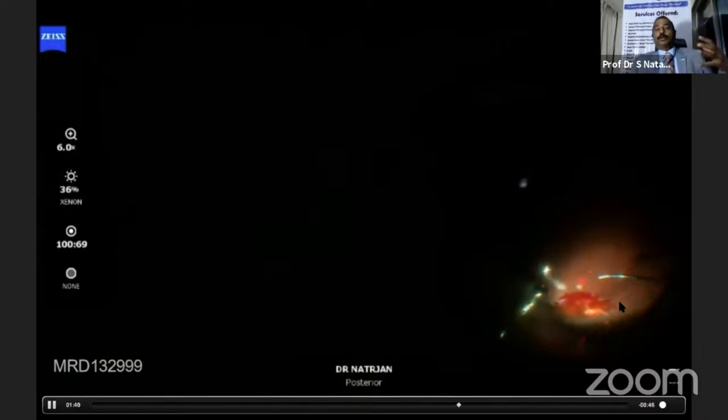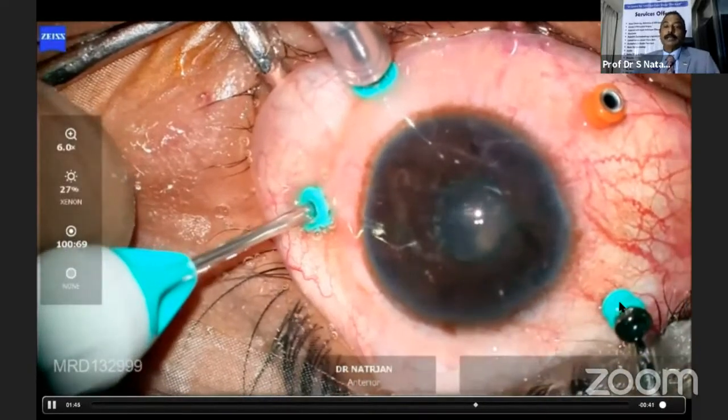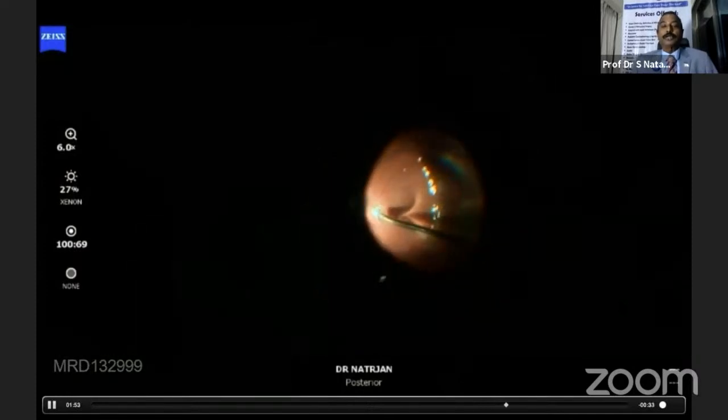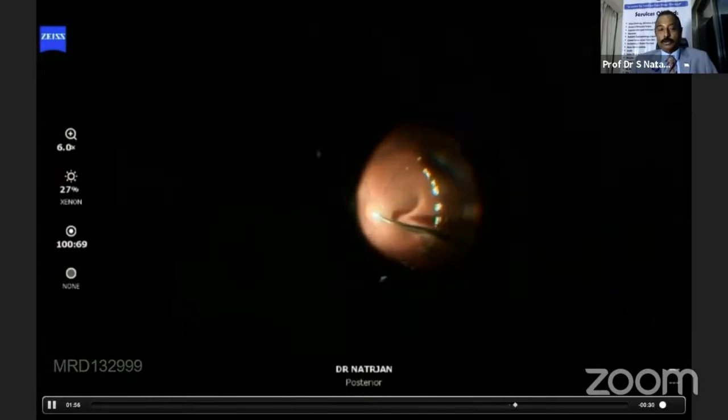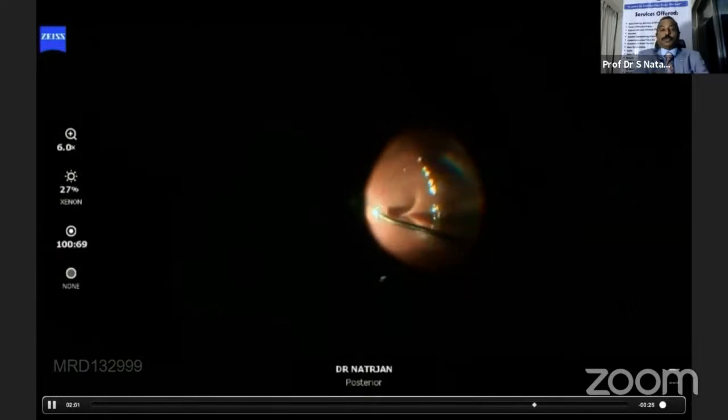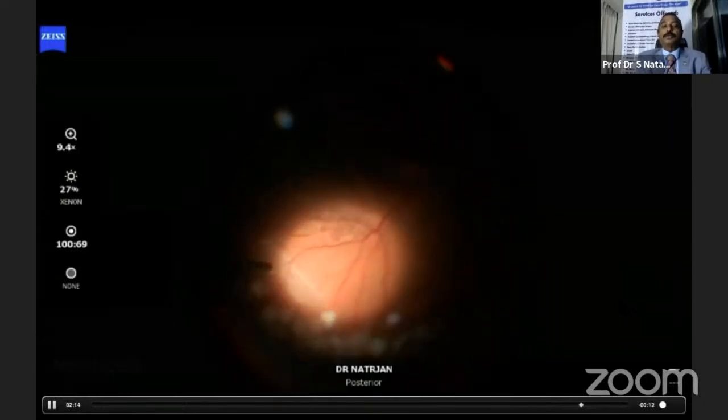And I think you have also improved the endo-illuminator, which can illuminate all 360 degrees, which is still a problem. And I think after that, you do a PFCL silicone oil exchange, and you can see the PFCL and oil, you don't see the meniscus, but using the 3D system, the things are so smooth, and you see a small rim of light, which is actually the oil where you're doing it, and you can see some PFCL bubbles, which will finally be removed using the retinal brush.